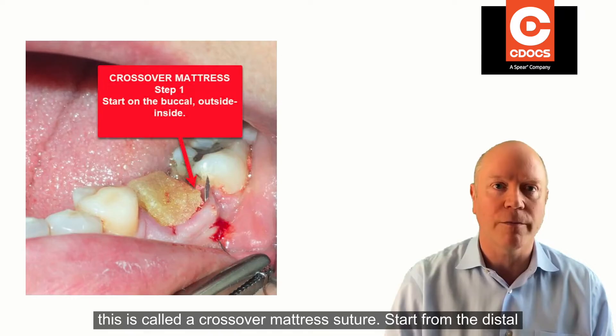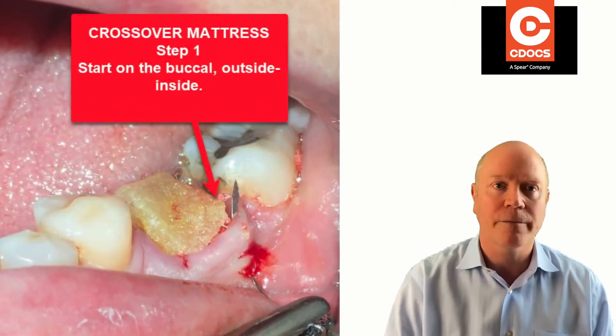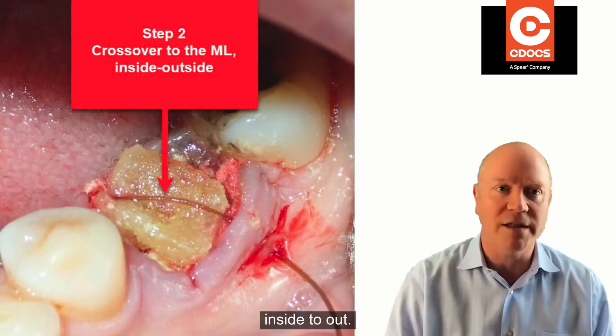To start the suture, this is called a crossover mattress suture. Start from the distal buccal — you go outside to in. Then you can see where that needle has come through; you bring it over and cross it over to the mesial buccal, and you go inside to out.